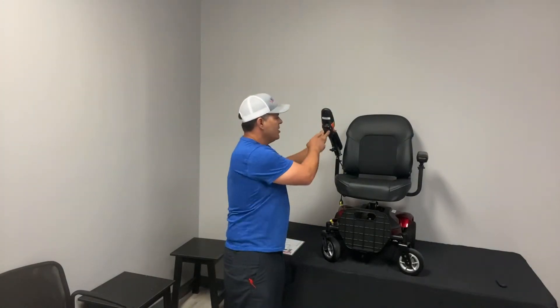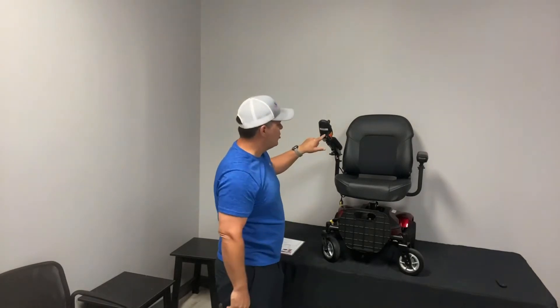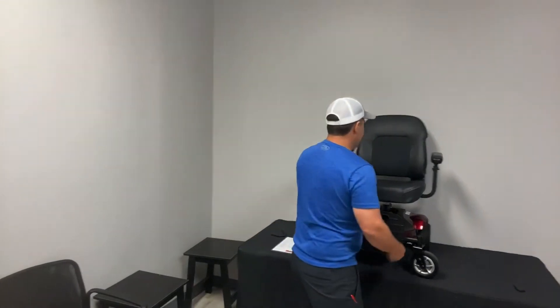I also want to mention — this is where you charge the unit, right here. I failed to mention that earlier, I apologize. There's a little three-prong setting; you charge it here and you'll be ready to go.